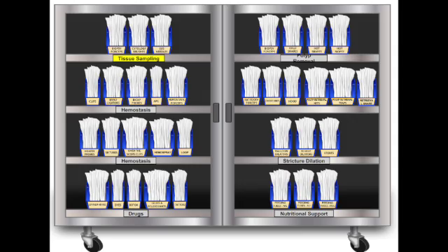And think about other uses too, tattooing. Injecting a tiny spot of ink to mark an area for future follow-up or for a surgeon. Right, localization. And even injecting botulinum toxin, Botox, into muscles, like in the esophagus for achalasia to relieve spasms. It's an incredibly versatile tool. It really is. Okay, next up, the band ligature or bander.